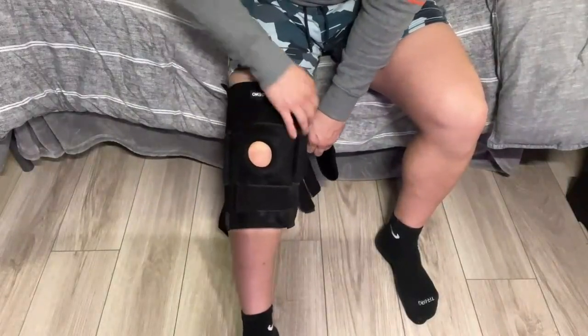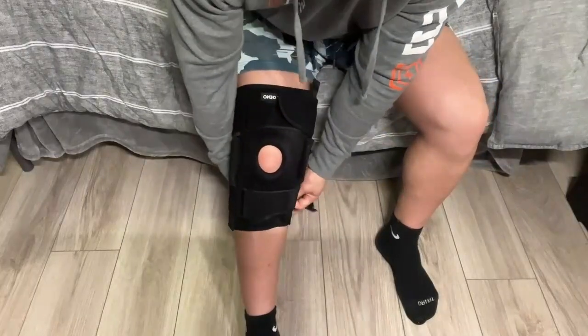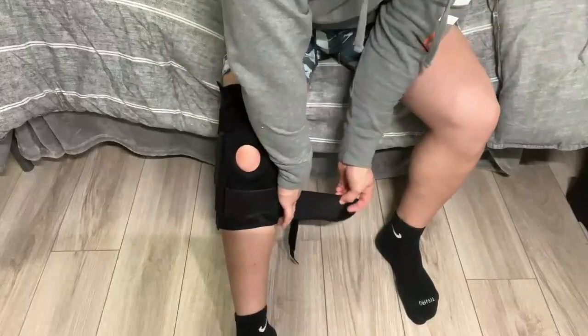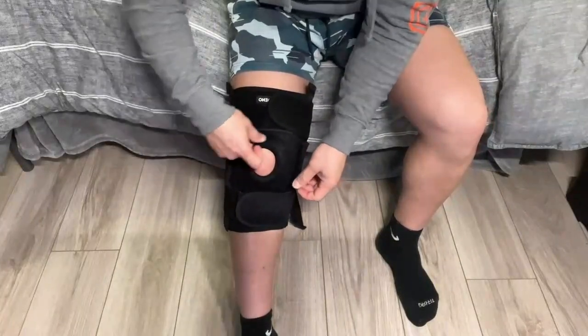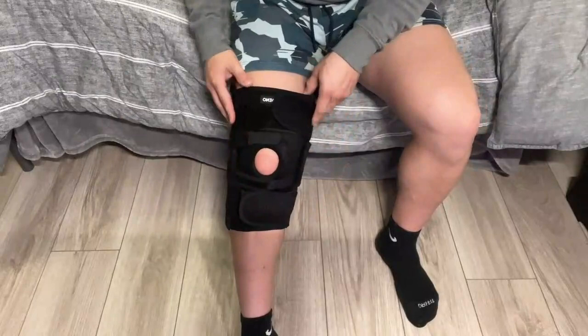Now we're going to secure the brace to our leg by slightly tidying the velcro — not putting any pressure, just like this. Then you have these two on the back. We're going to do the same thing there.